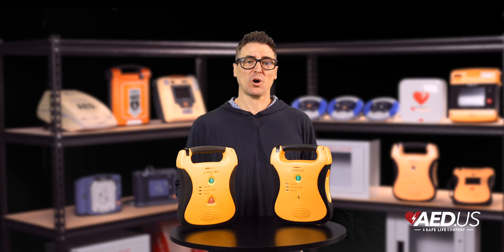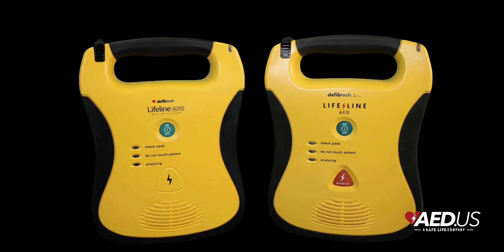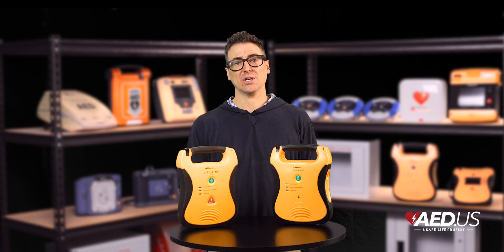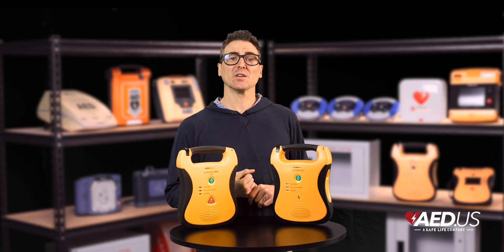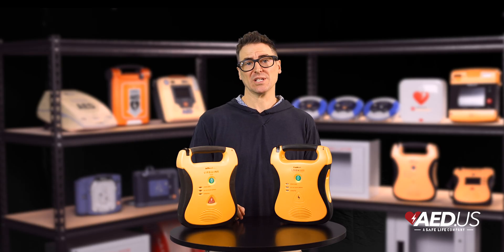The Lifeline AED also offers a long-life battery for extended reliability. The battery options provide up to seven years of standby life, ensuring the device is always ready when you need it.